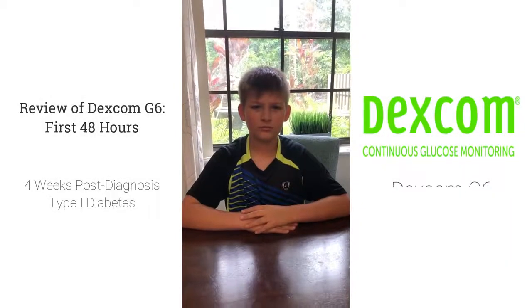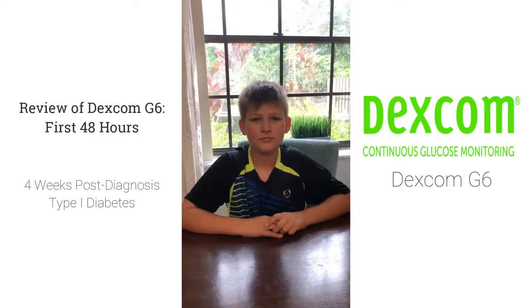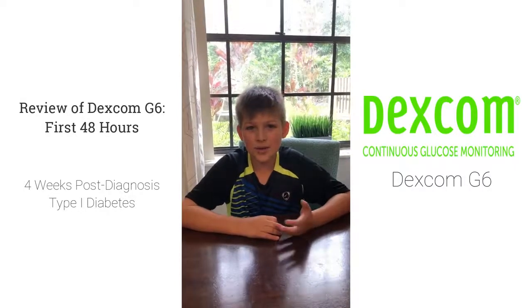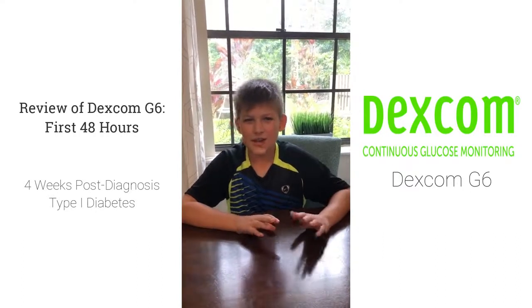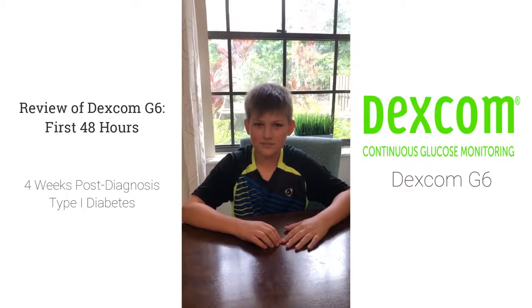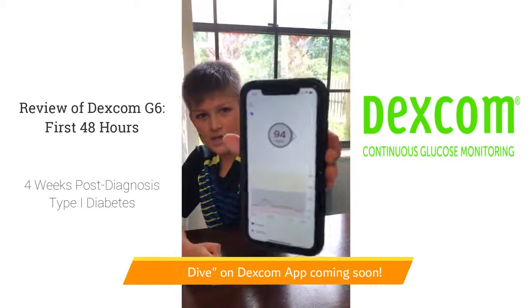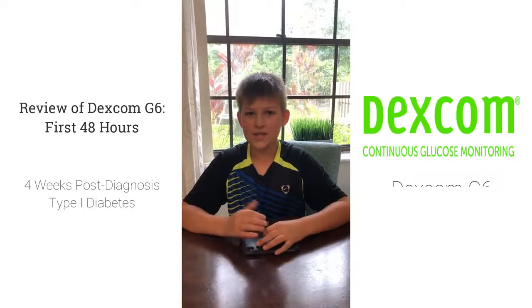Hey Zach, it has been officially 48 hours since you've had the Dexcom on. What has your experience been — good, bad, ugly? So basically, this Dexcom is actually really helping, so I wouldn't have to take these pricks all day. Because the pricks don't necessarily hurt, but it's kind of annoying — sometimes it doesn't read it right. With the Dexcom, it's just on your phone and it uploads every five minutes. Right here it says I'm at 94, and I didn't have to take a prick for it. And you put it in every ten days.